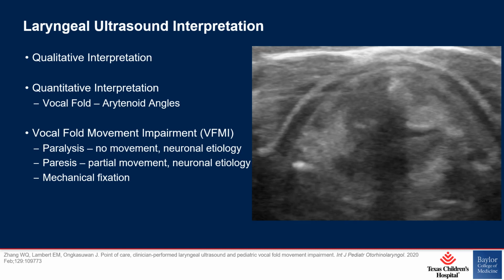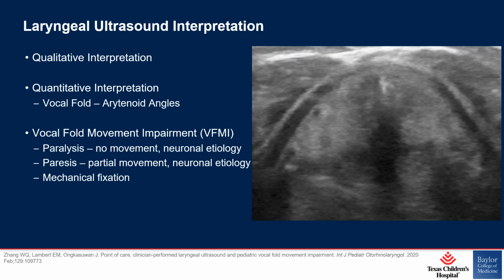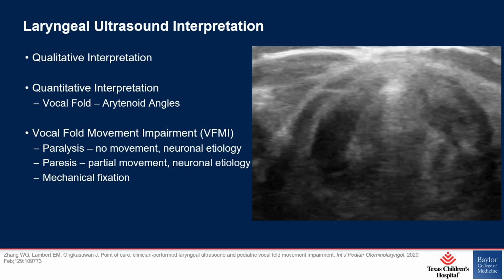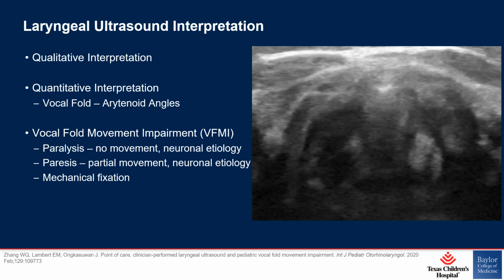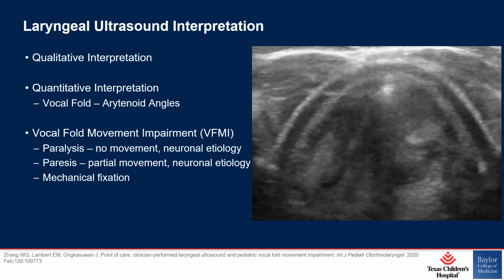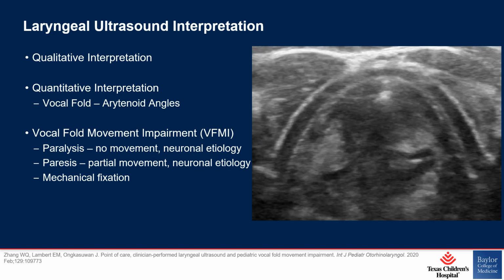Neither laryngeal ultrasound nor flexible nasolaryngoscopy can determine the etiology of a vocal fold movement impairment. Thus, the term vocal fold movement impairment is preferred over paralysis, paresis, or mechanical fixation in this module.